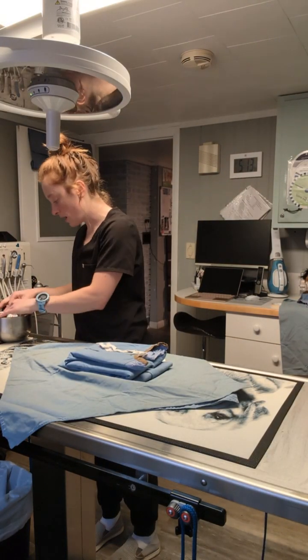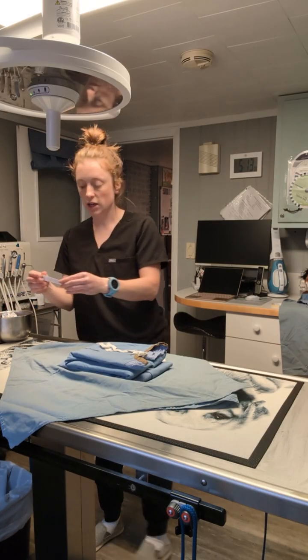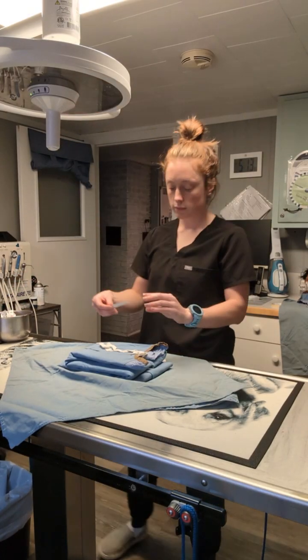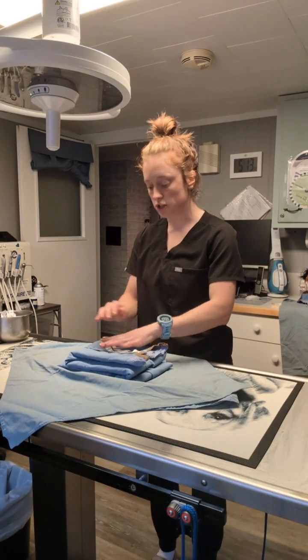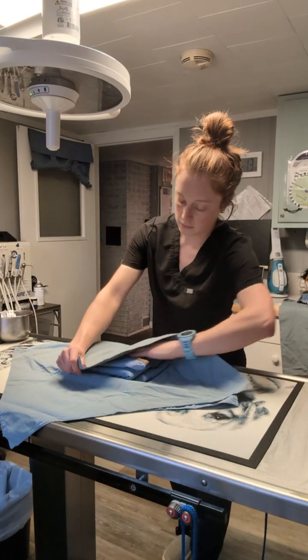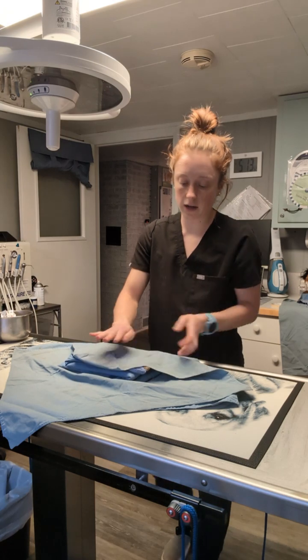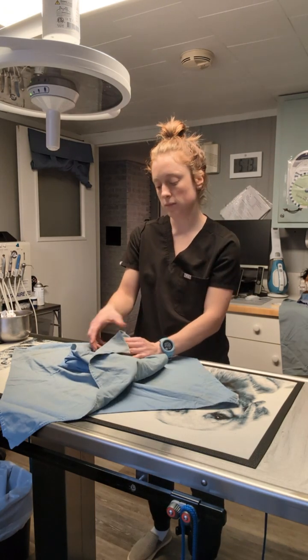Don't want to forget to add in my sterilization indicator into the center to make sure the sterilization goes all the way to the center of the gown. I'm going to fold up the bottom corner, folding back the corner so it's easy to grab.